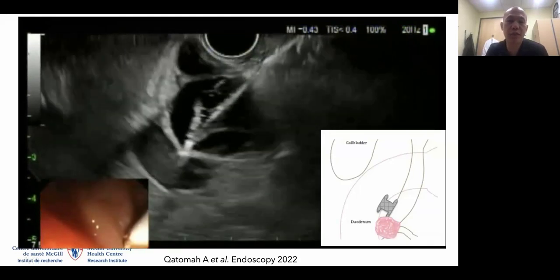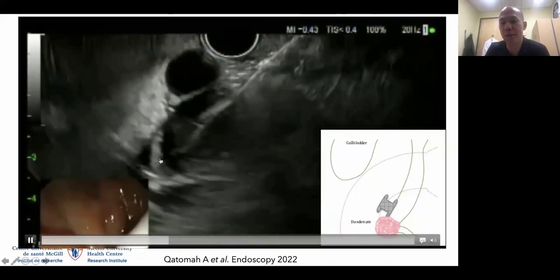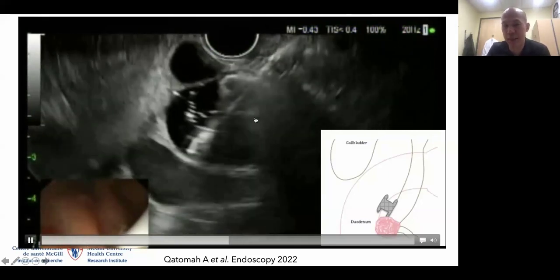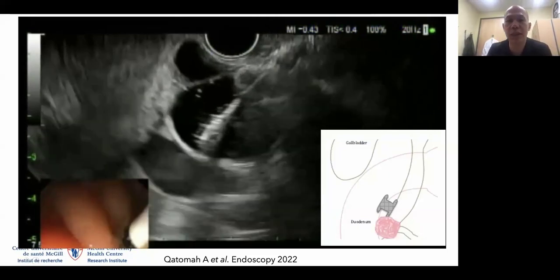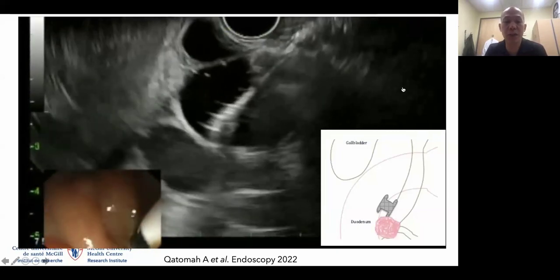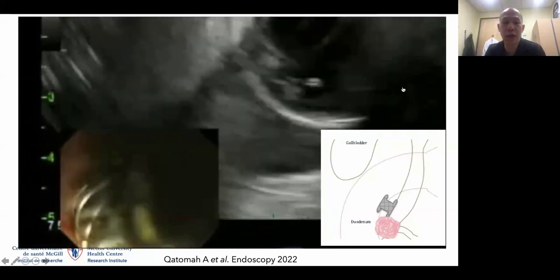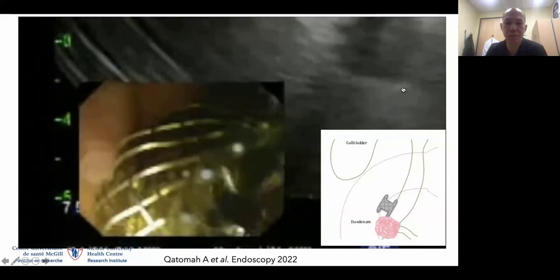We push the stent forward. I know it's against the portal vein. It's a little scary looking, but it's a very blunt tip. We then release the distal flange. You can see the dumbbell, the saddle-shaped stent coming into view. And this is not really edited. It's a very fast procedure and quite easy to perform. We then release the proximal flange. You can see here, this is from the duodenal bulb, and the bile duct is draining very nicely in the bulb of the duodenum.